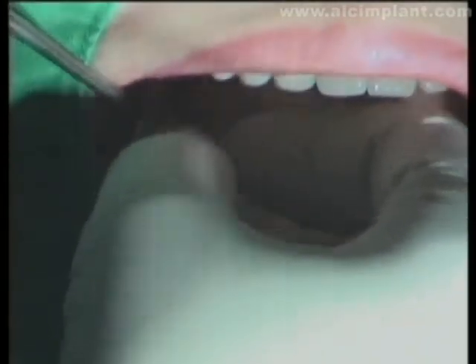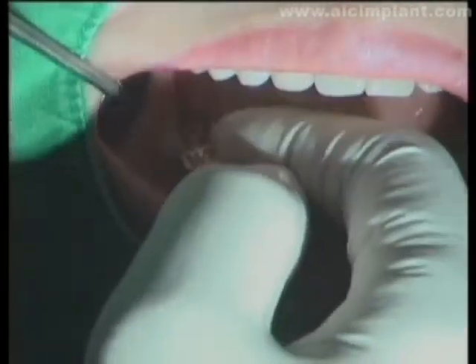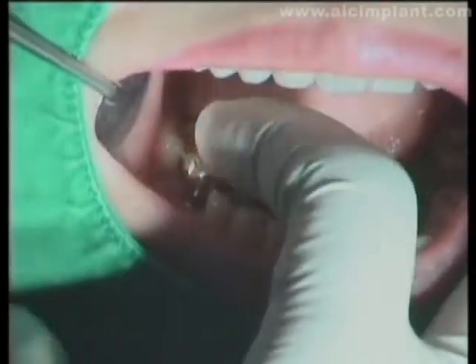Afterward, attach the final prosthesis inside the patient's mouth and check its margin.